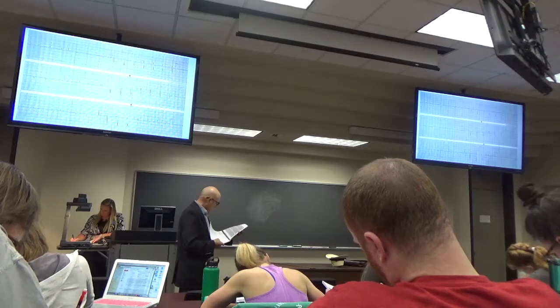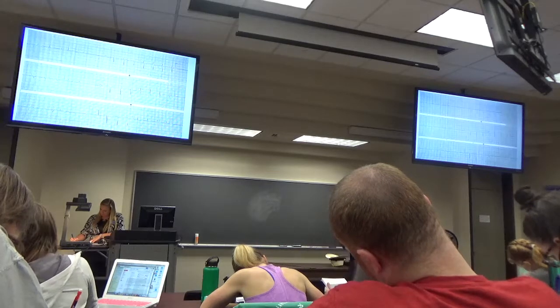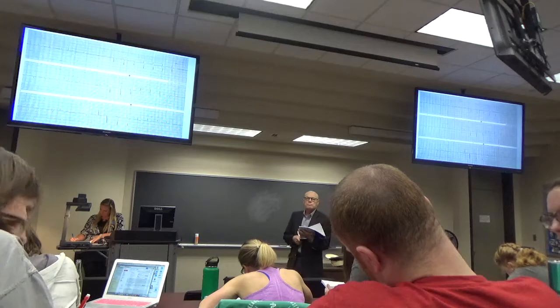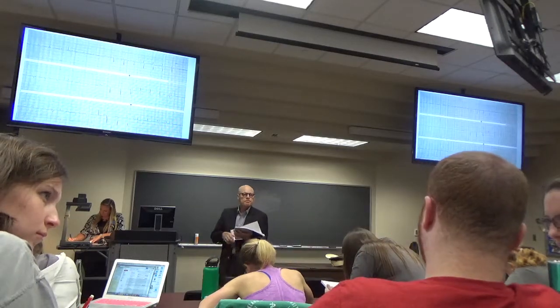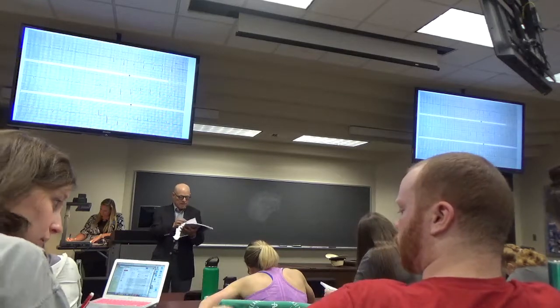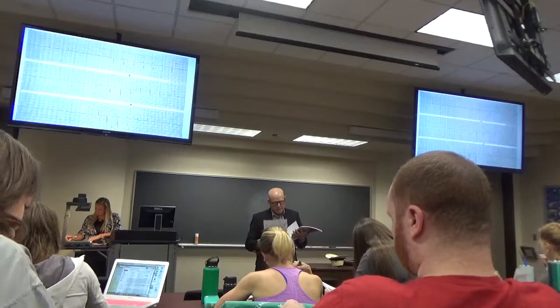Everyone look at lead 2 and lead AVF. See if you find the short PR intervals. You see them? I got 0.12. 46. Bethany?